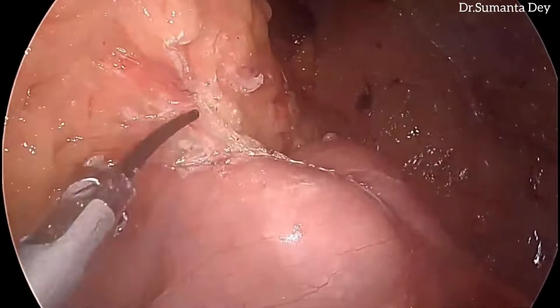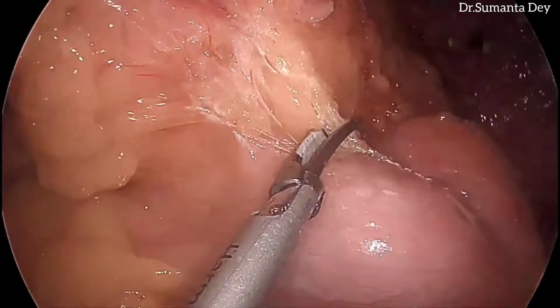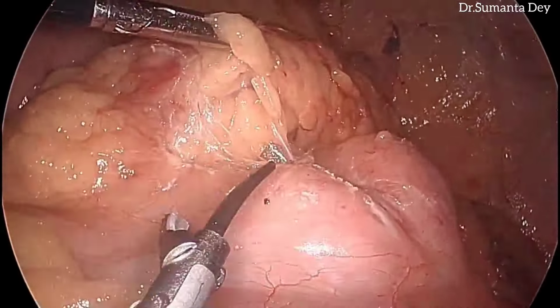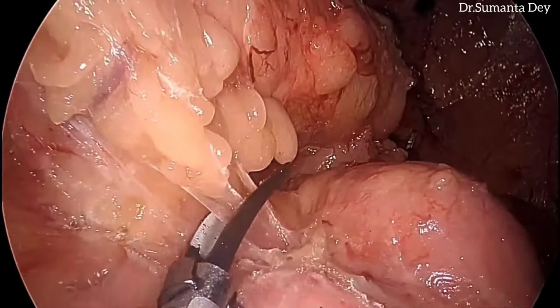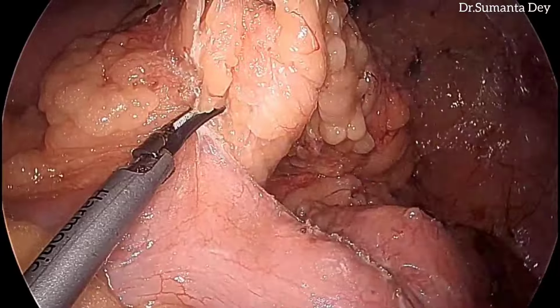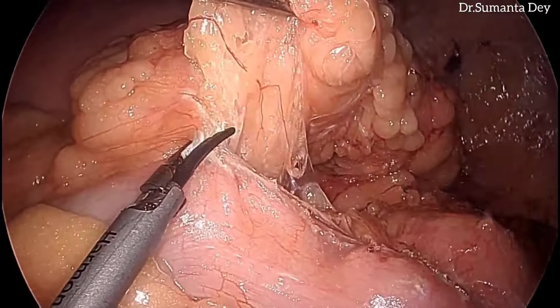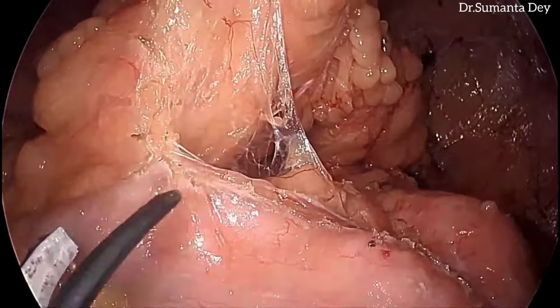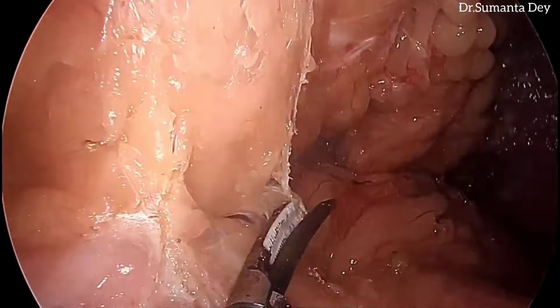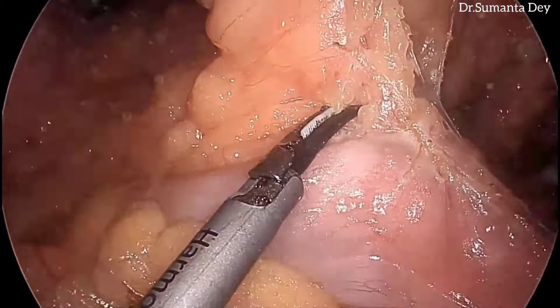Now further dissection towards the mid transverse colon is being done. So the greater omentum is being divided, and gradually, from the tumor margin, at least 5 centimeter proximal dissection is done. So from the tumor margin I have divided the greater omentum 5 centimeter proximal.